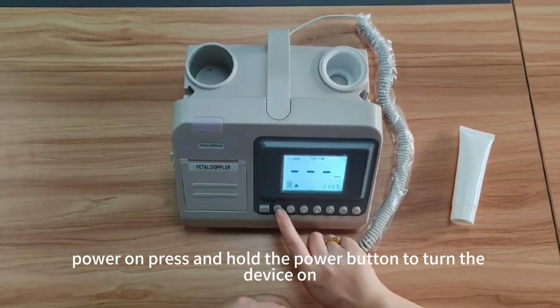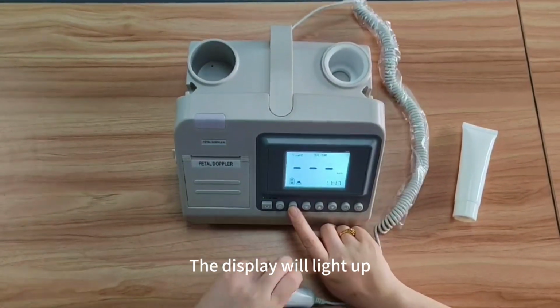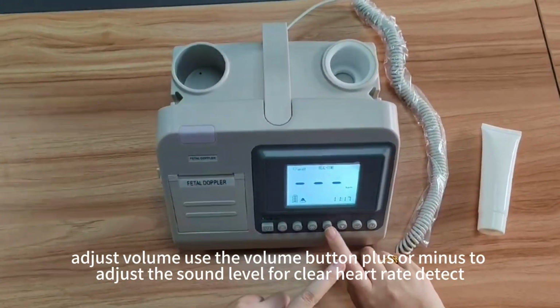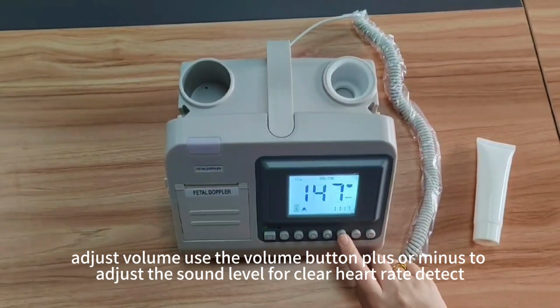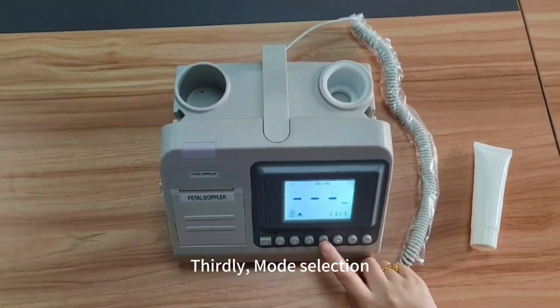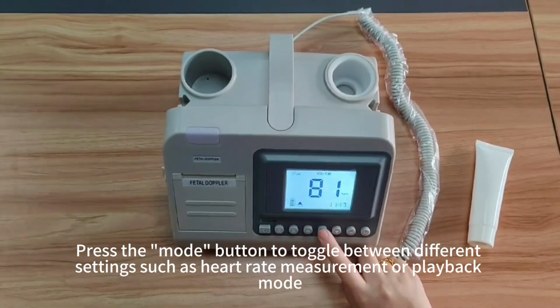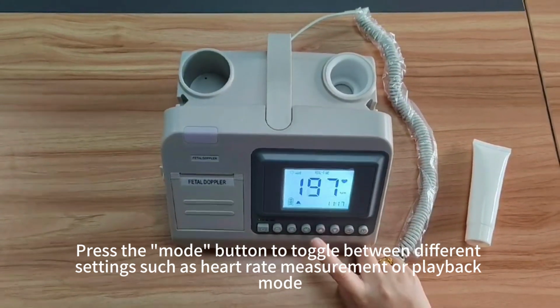First, power on. Press and hold the power button to turn the device on; the display will light up. Second, adjust volume. Use the volume button plus or minus to adjust the sound level for clear heart rate detection. Thirdly, mode selection. Press the mode button to toggle between different settings such as heart rate measurement or playback mode.